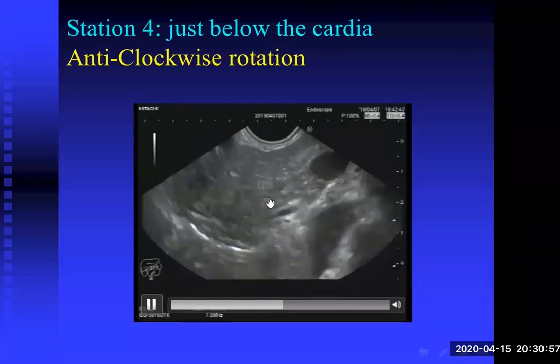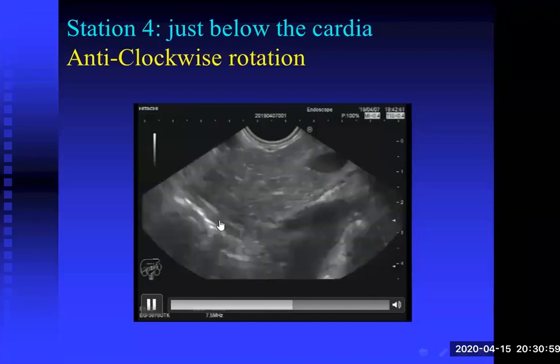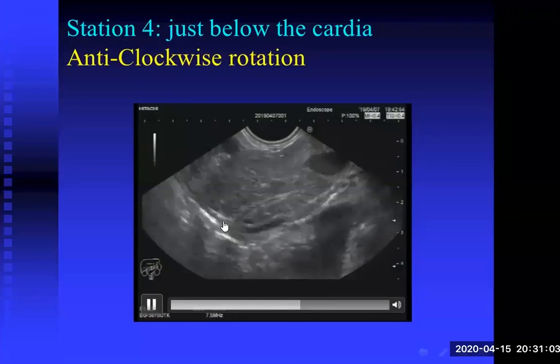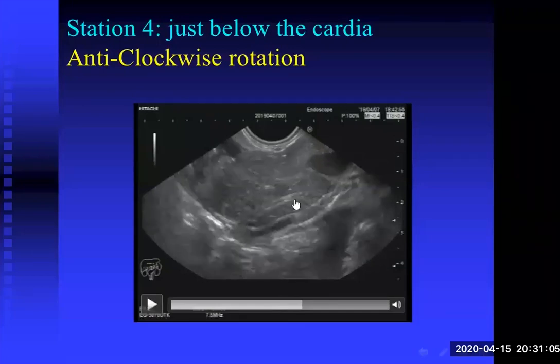And this is the venous confluence. And this is the papillary region. Yes, here it is very nicely seen. This is the common bile duct, and this is the pancreatic duct joining each other at the region of the papilla. And this sign tells us that there is no pancreas divisum. The main pancreatic duct is normally joining the common bile duct at the region of the papilla.